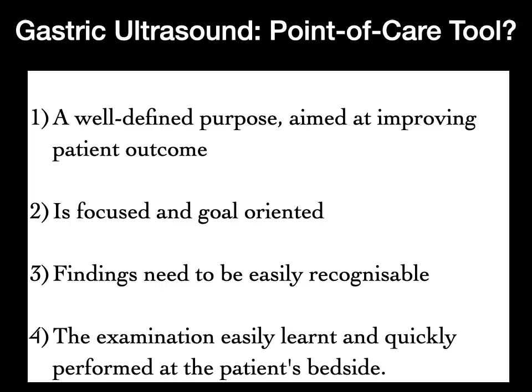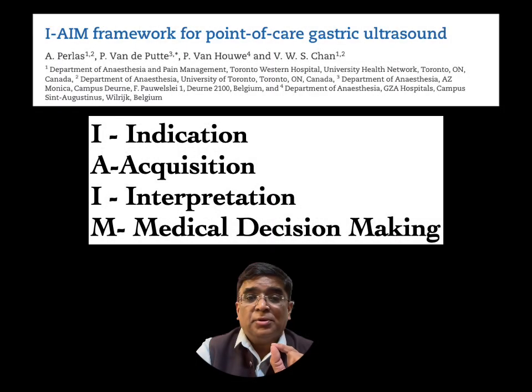Yes. Is it focused and goal-oriented? Yes. Can the findings be easily recognized by everyone? With proper training, everyone can recognize the stomach, everyone can recognize the contents in the stomach. The examination can be easily learned and quickly performed at the patient bedside and improves the outcomes.